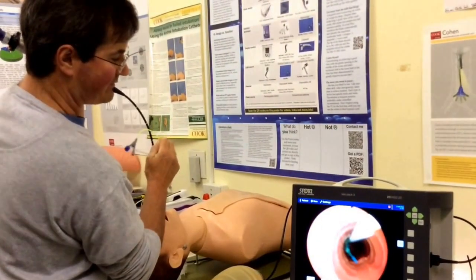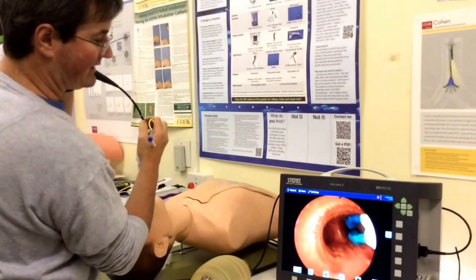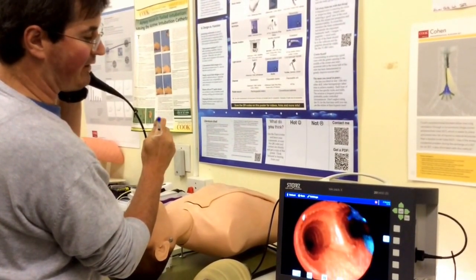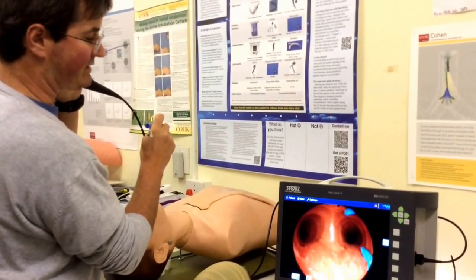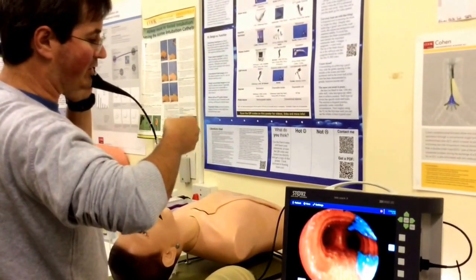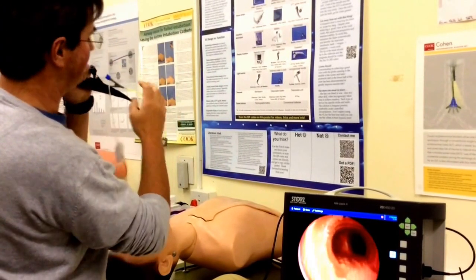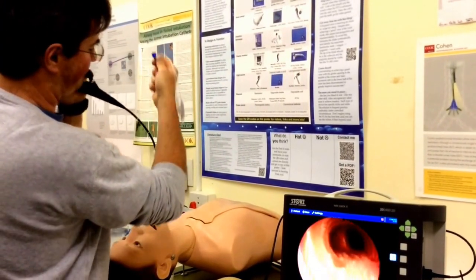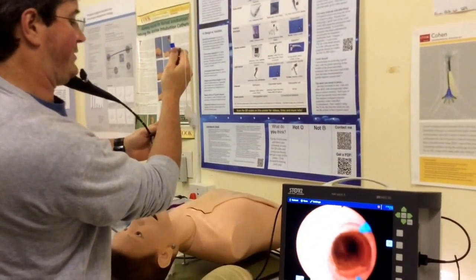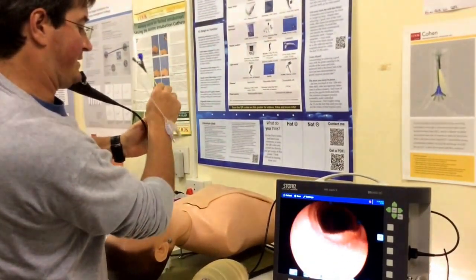Advance the blocker until it pops out the end. Now we are into the trachea and I can follow it and see where it's going. If both legs are going down the right main bronchus, come back a little bit, rotate the bronchial blocker — twist it at the top — and then advance. It's always easier with an assistant, especially if there's a step in the trachea.